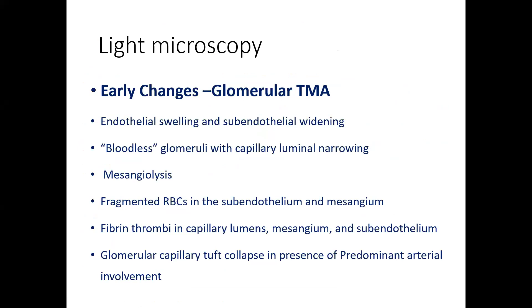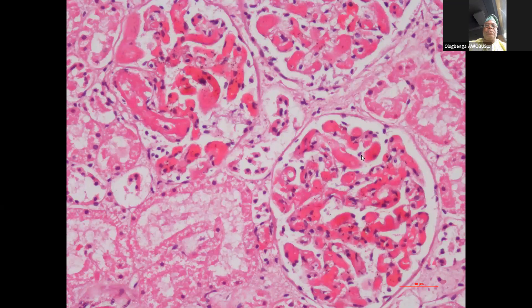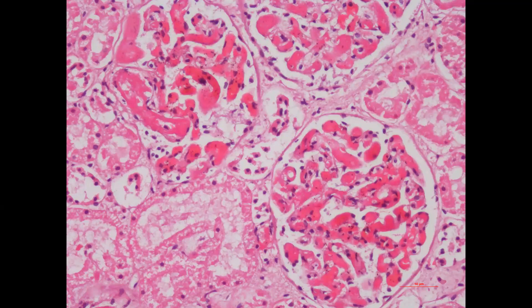The early changes of TMA include endothelial swelling (endotheliosis), bloodless glomeruli, mesangiolysis, fragmented red blood cells, fibrin thrombi, and glomerular capillary tuft collapse. On H&E, we can see dilated and distended capillary lumens occluded by homogeneous eosinophilic material — fibrin thrombi — present both in glomerular capillary lumens and the arterial wall. On Masson trichrome stain, fresh fibrin is orange/fuchsinophilic; old fibrin appears blue. Fibrin thrombi can be confirmed using MSB stain.